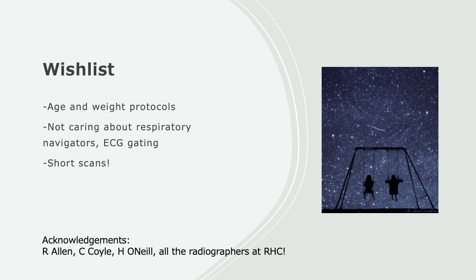Finally, our wish list. I think that it would benefit our department to have age and weight dependent protocols, and this would save time and help the radiographer plan their scans. Ideally, we wouldn't have to care about respiratory or ECG gating navigators, and I know there's research out there on acquiring those images without them, and this is something that we would ideally need in paediatrics. And finally, having short scans. Although we have overall reduced our time in the scans, something even quicker would be ideal.